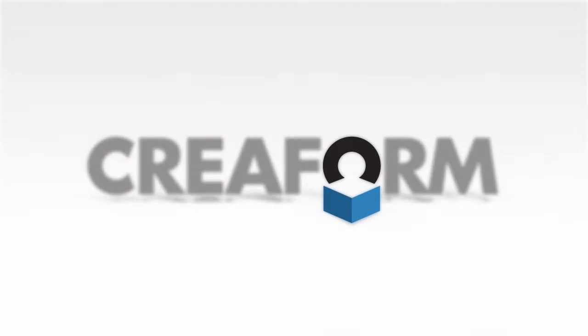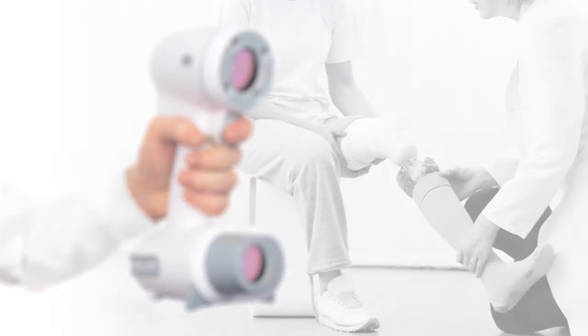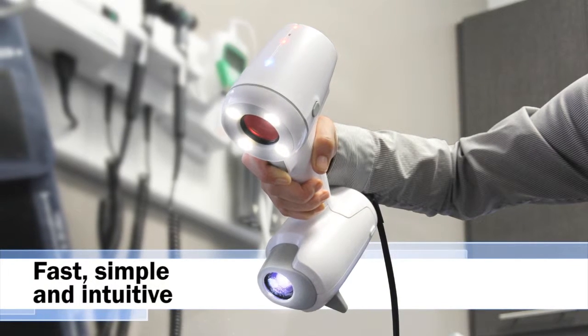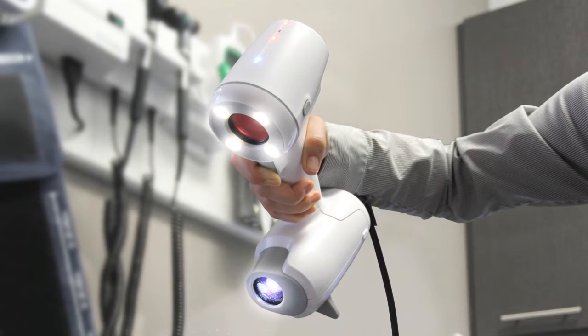Creaform. Simply the right fit. The Creaform Healthcare Partner 3D Scanner is fast, simple and intuitive, and it has been designed with healthcare providers in mind.